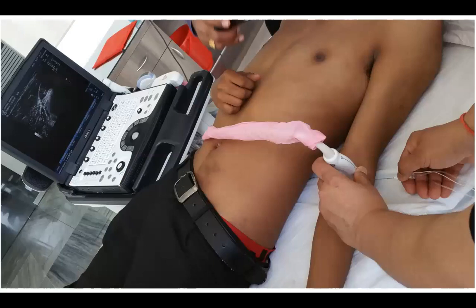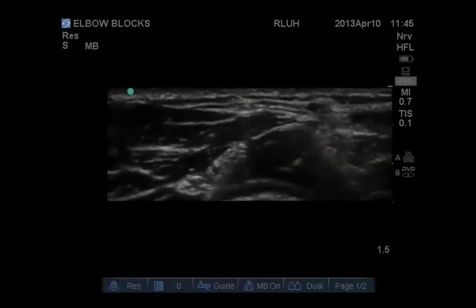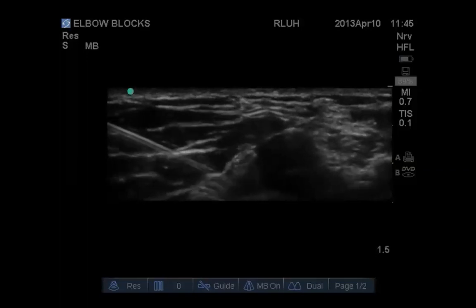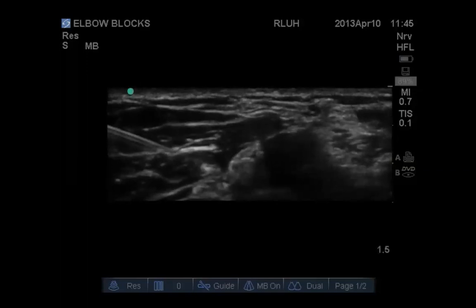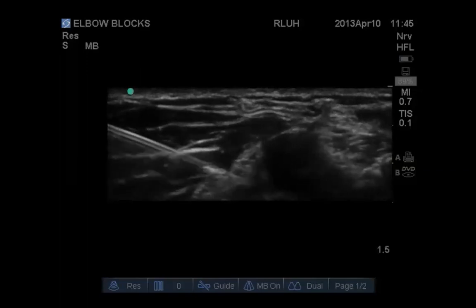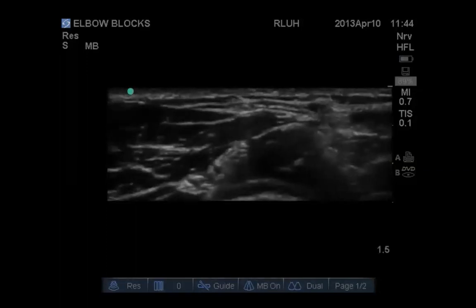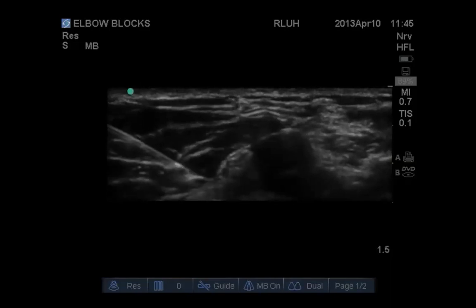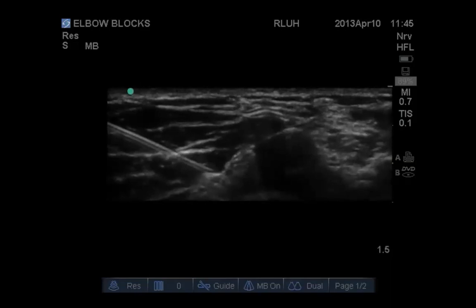For the ultrasound-guided radial nerve block, place the probe in the cubital fossa slightly laterally and you will likely see the nerve straight underneath — it gives a characteristic 'snake eye' appearance. The needle comes from the lateral side, passing under the nerve, and you deposit local anesthetic just under the fascia. Be careful directly under the nerve as an arterial branch can be seen pulsating there; you don't want an intra-arterial injection. Use around 3–5 ml of 0.375% or 0.5% bupivacaine.